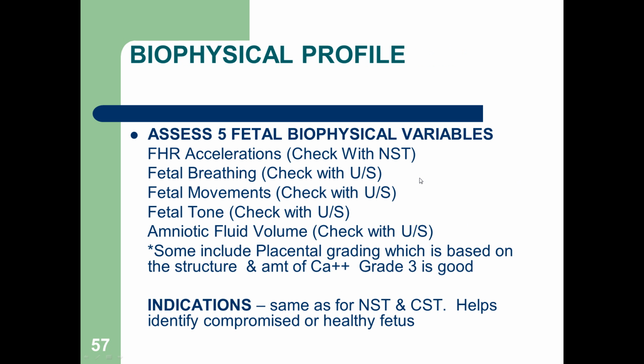Okay? I'm going to just let you read this biophysical profile. You can read this in your book as well, but I did put that on there because some facilities will use this to determine fetal well-being, and the indications are the same as a non-stress test or CST. Okay? It's helping us to identify whether the baby's compromised or if they're healthy. Okay?